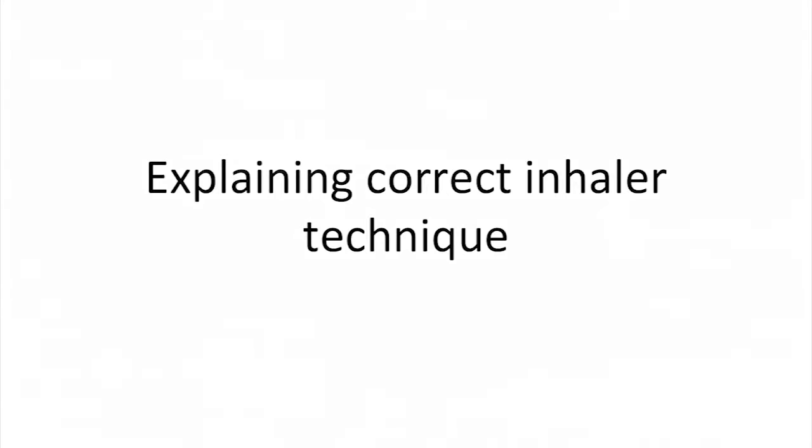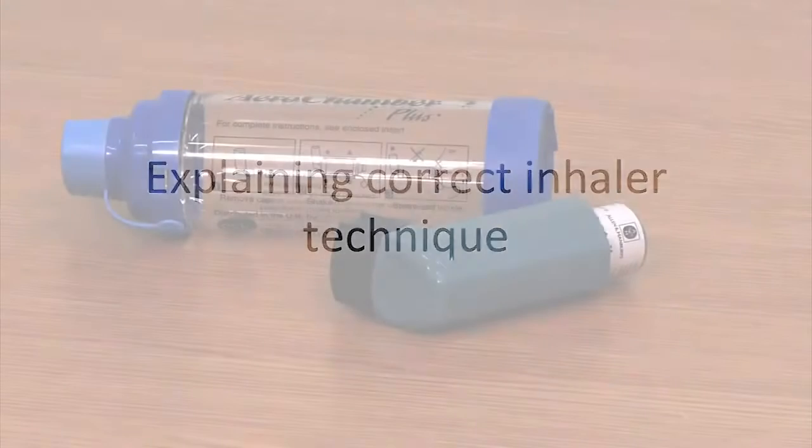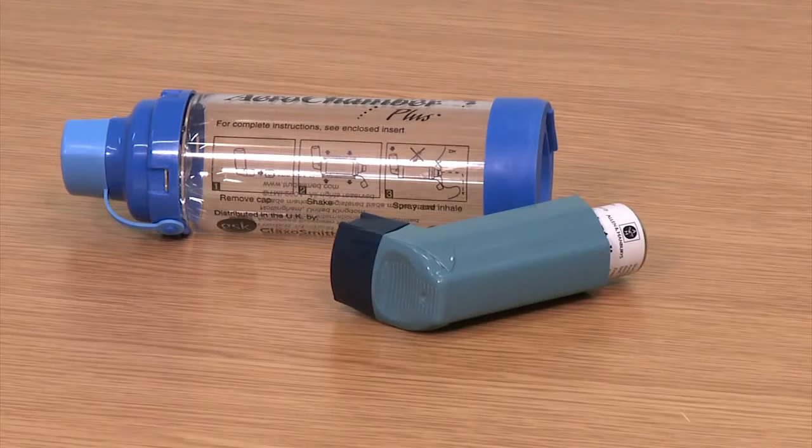Inhalers come in many varieties. These include metered dose inhalers, often abbreviated to MDI, and dry powder inhalers. This video focuses on correct explanation of MDI technique, both with and without a spacer device. For other inhalers, see the manufacturer's instructions.